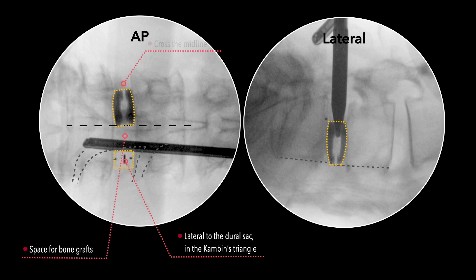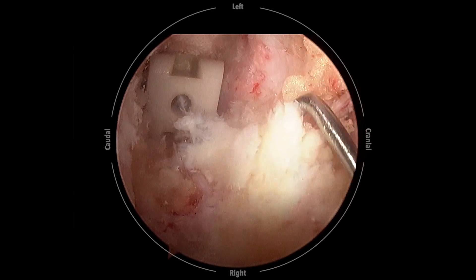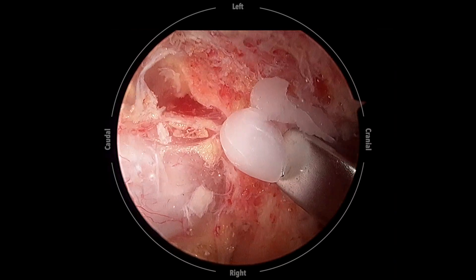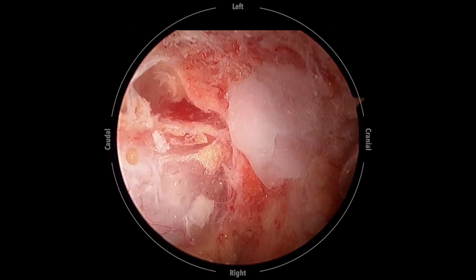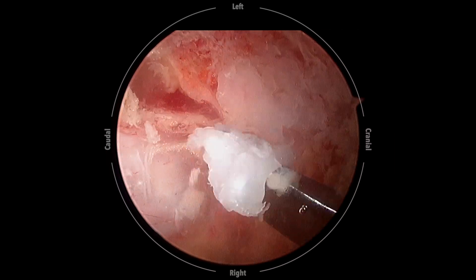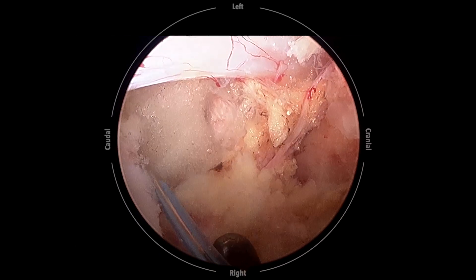Cage insertion and its final position are monitored and confirmed using fluoroscopy. The endoscope is used to check the adequacy of neural decompression. Ipsilateral foramen decompression can be accomplished now to release the exiting nerve root. Irrigation is temporarily stopped to check dura pulsation and identify any active bleeders. The radiofrequency wand is used to coagulate bleeders, and bone wax is used to seal the cancellous bone. A drain tube is mandatory to reduce the risk of epidural hematoma.